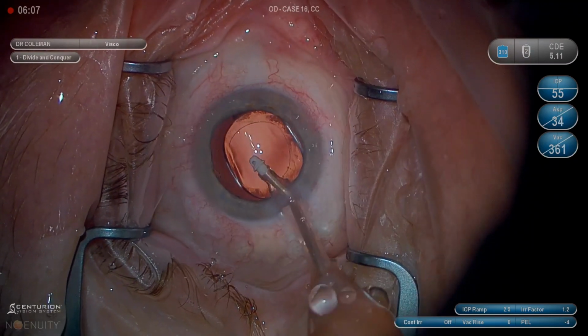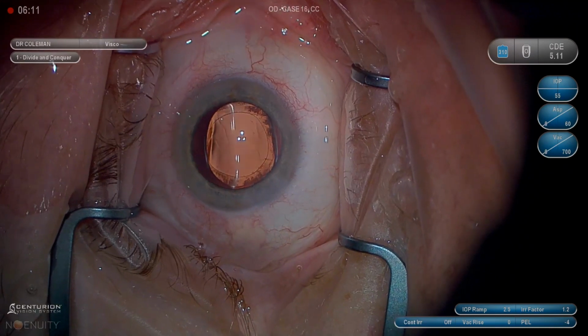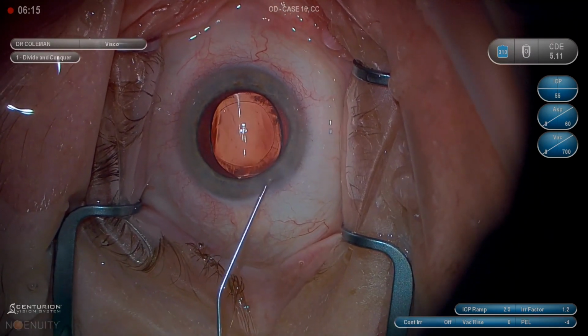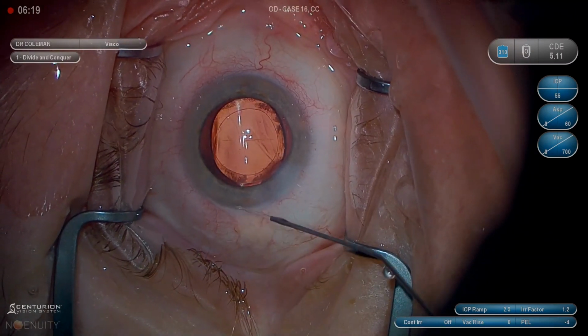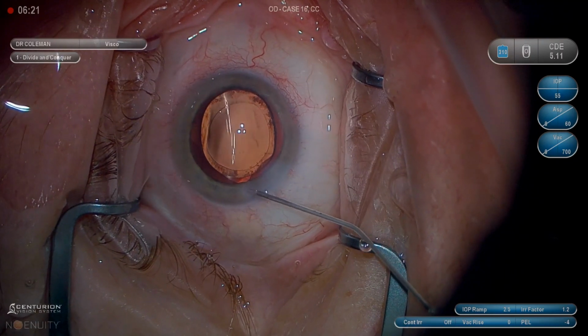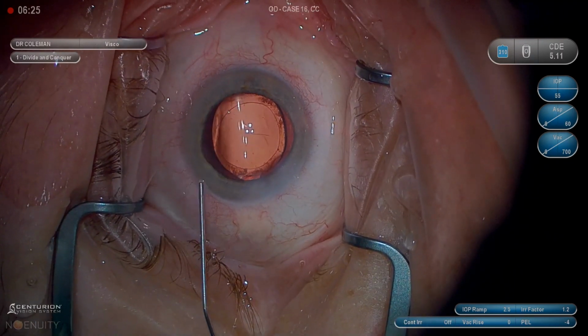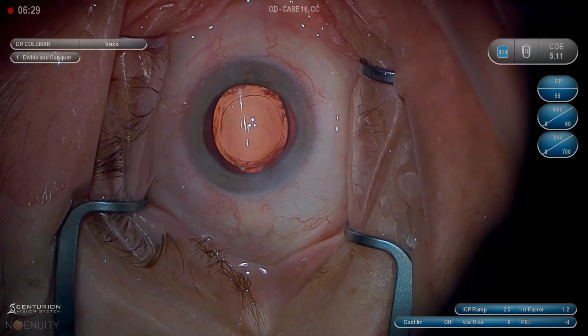Now, a common source of a main wound leak is the inner leaflet of the wound, especially if it has a triangular edge on it, which can flip back out. So the lower portion of the wound can flip back out of the wound, and even if you've done a good hydration, it will keep leaking. It'll persistently leak, even at a normal pressure. And my partner calls it a dirty burp.